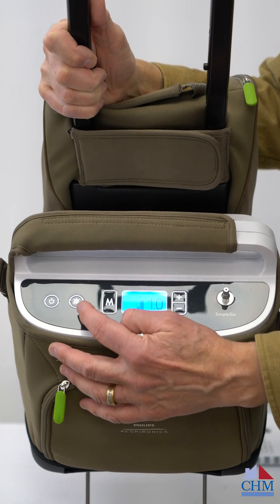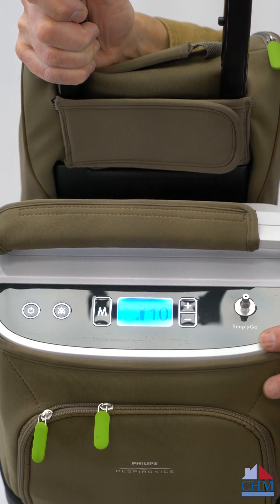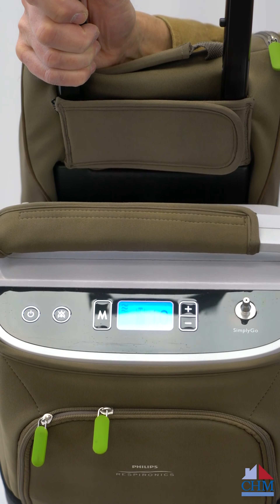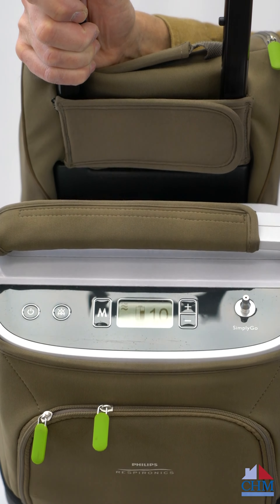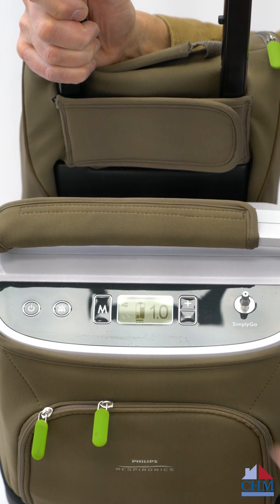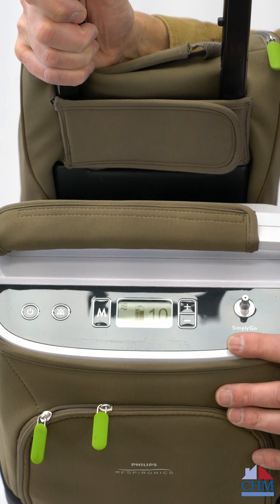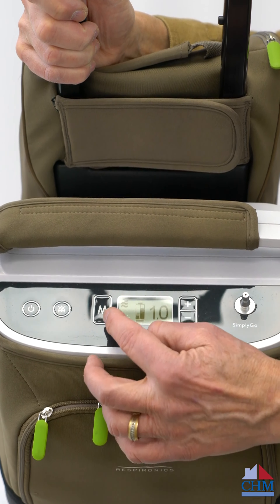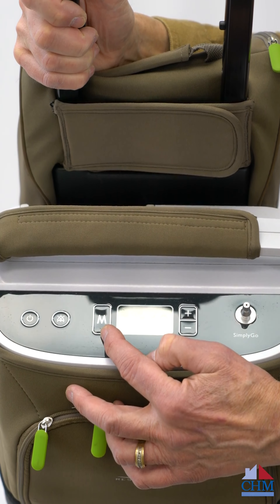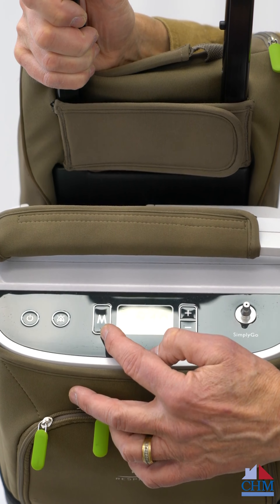Next to the power button there's an alarm silence button. The unit has alarms — it'll alarm if we're in pulsing mode and the patient does not breathe on it, if there are internal problems, low oxygen content, and similar issues. The symbols will come up on the screen, and you can hit silence if needed. The mode selector — that's the M button — switches us from continuous flow to pulse mode.